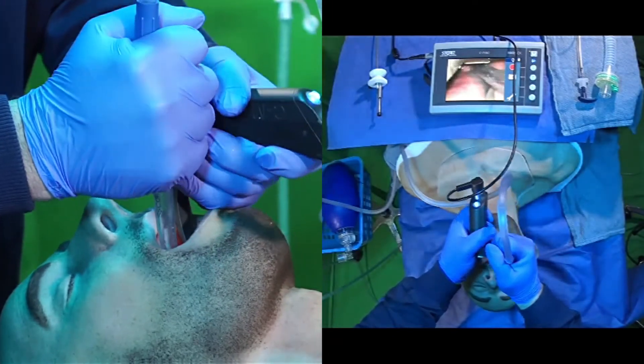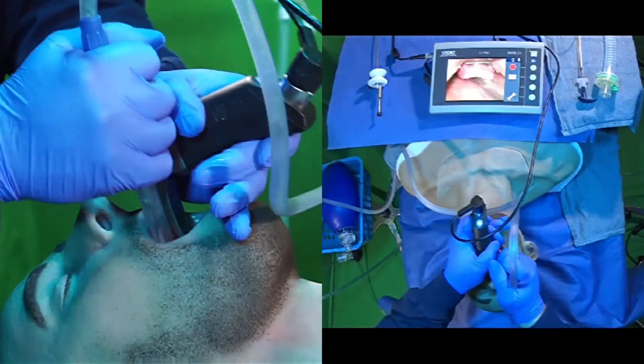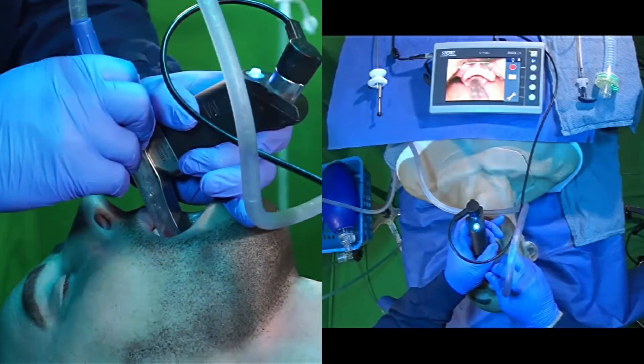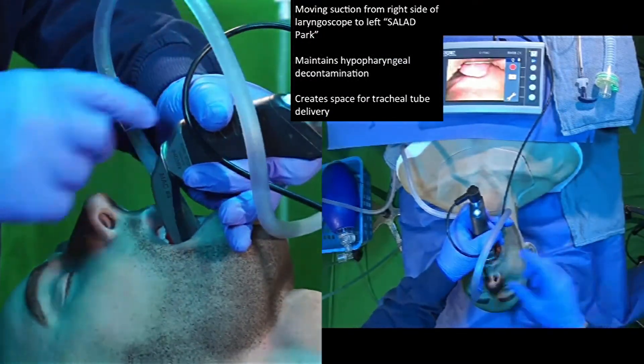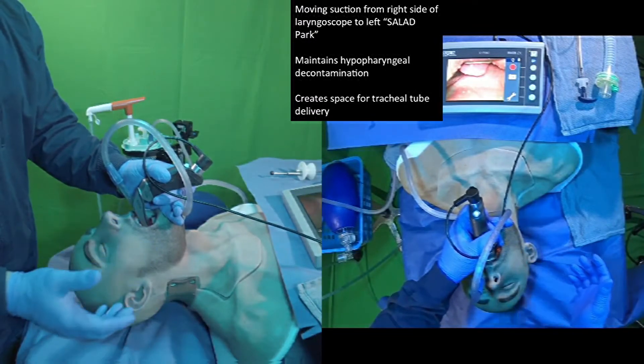Once the laryngoscope is in the mouth, we can easily suction our way down to the airway. We can visualize the vocal cords, make sure there's no secretions inside the glottic opening. And once it's all clear, we'll just quickly pin that catheter, following the esophagus on the left-hand side of the blade so we can free up the right side of the blade for tube placement.